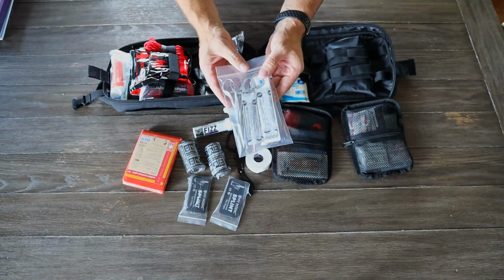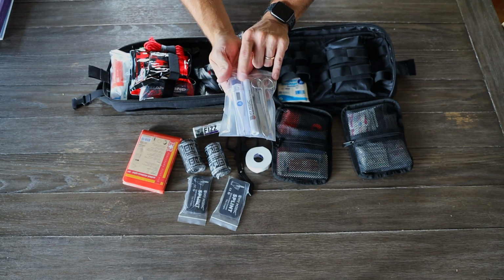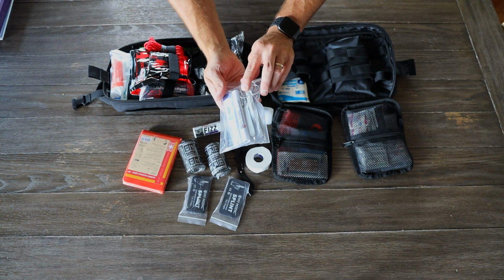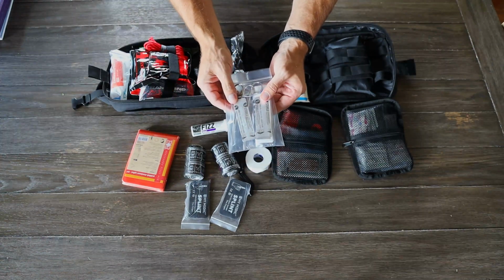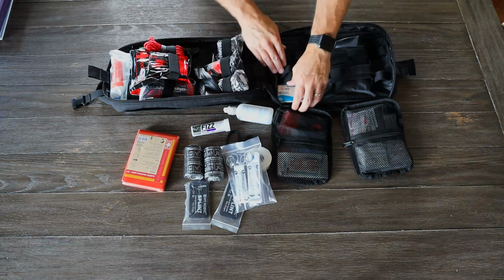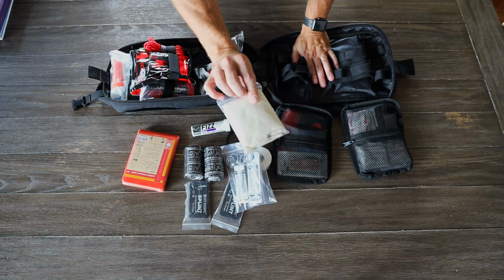Here we've got a kit full of smaller accessories. You've got a small light, thermometer, a couple different sizes of tweezers. You've got a couple different hemostats available, and then you've also got some scalpel blades in there for various uses. Triangular bandage.